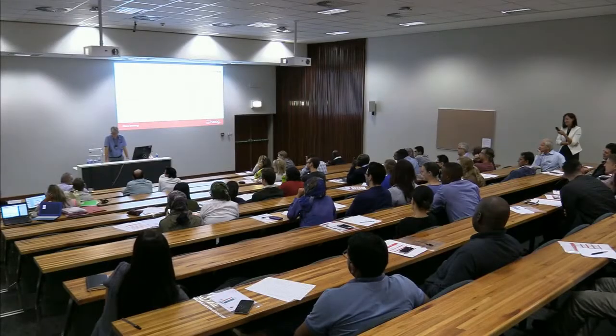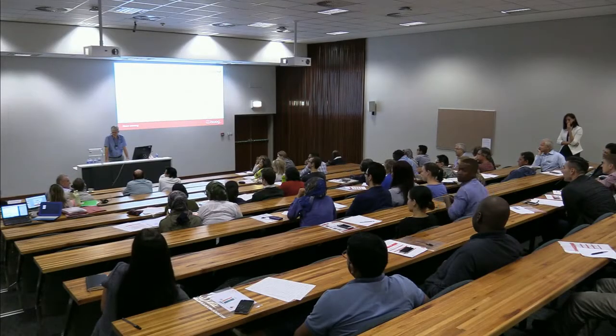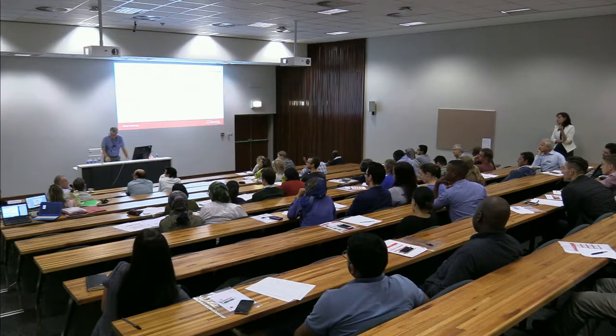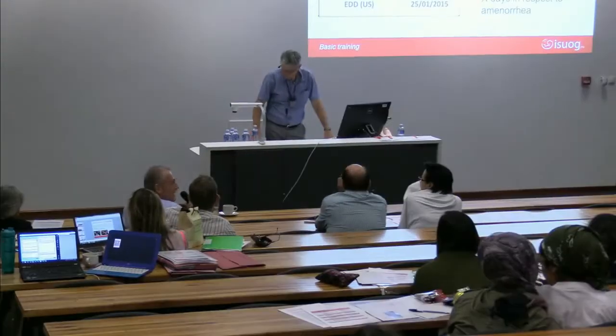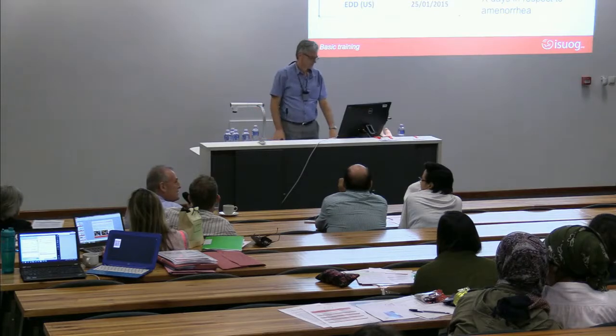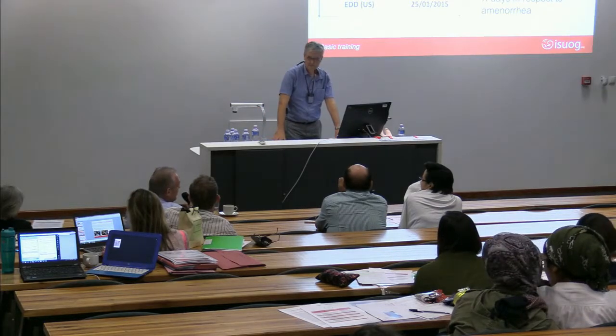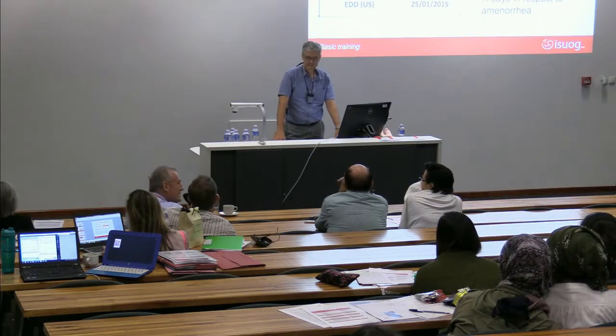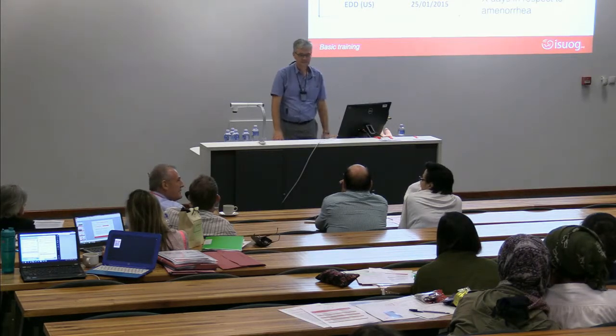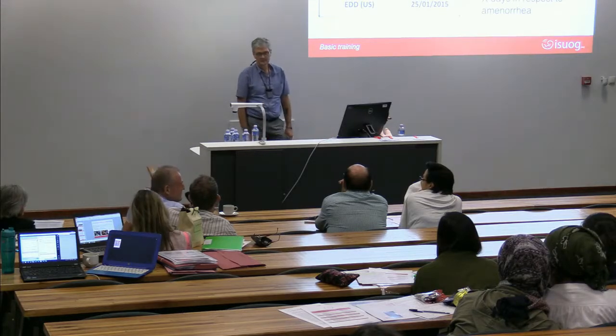I think it's important to mention here, because we all rely on the ultrasound machines to tell us, based on the crown to rump length measurement, what the gestational age is. You've got to be familiar with what formula has been used on your machine to establish the exact gestational age, because a different formula, Hadlock, let's say, will give you a different gestational age to Robinson, which is the one that the FMF uses for the determination of the risk of chromosomal abnormalities. So 40 millimeters, for example, with Hadlock will give you 11 weeks, but 40 millimeters with Robinson will give you 10 weeks and 3 days.